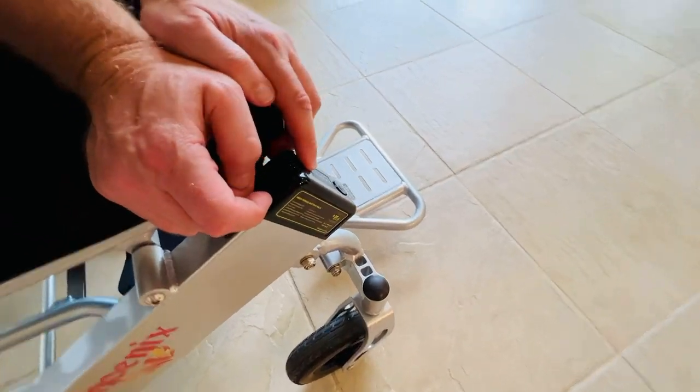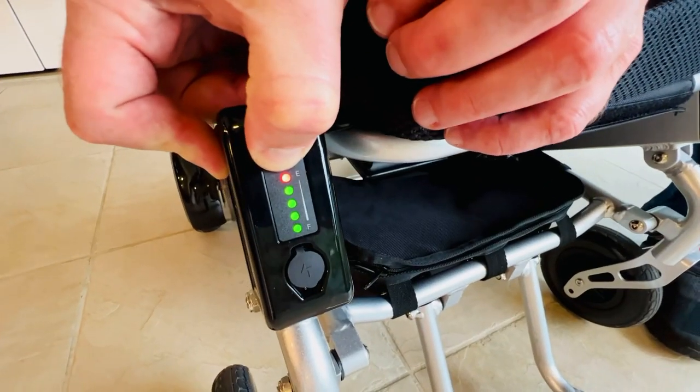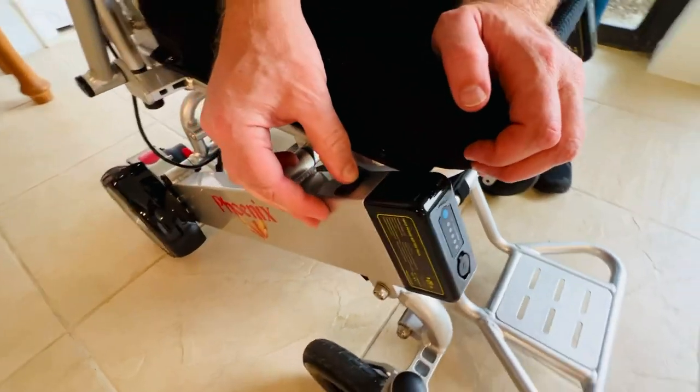And if I turn that off, there is an indicator on each battery that will illuminate and disappear when the batteries drain.